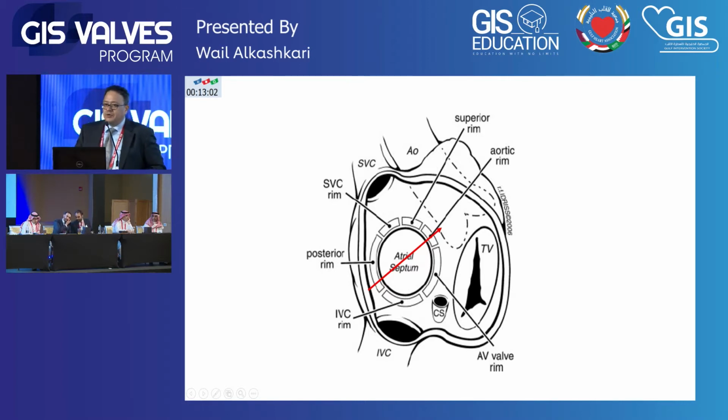The three standard views in ASD closure are the TEE short axis at the aortic level, which is at 45 degrees. Usually you see the aortic rim, and you see the inferior part of the posterior septum. These two rims are the least important for ASD closure. The rest are mandatory, and you have to have at least 5 millimeters of each of the rest. So at 45 degrees, you can see these two rims.